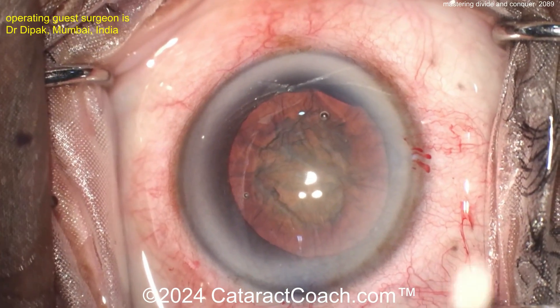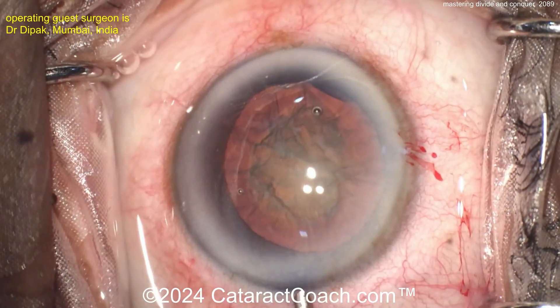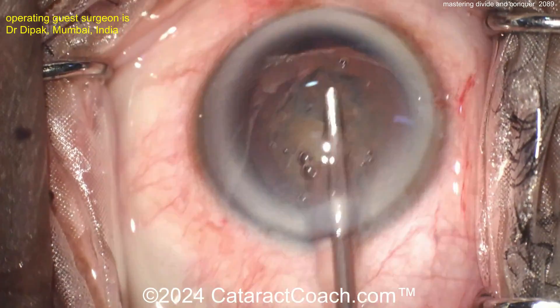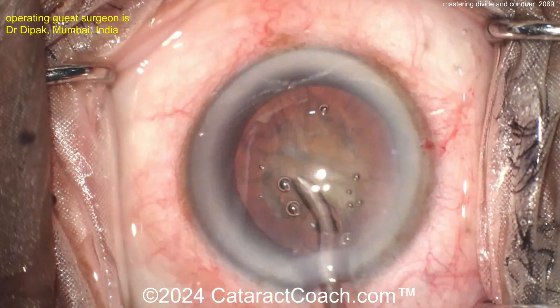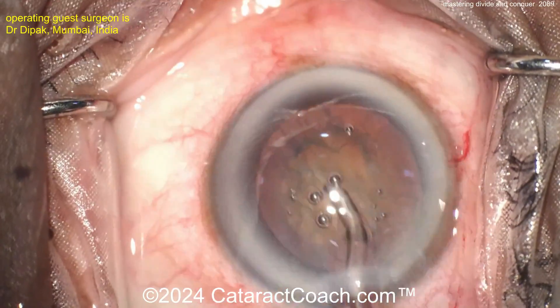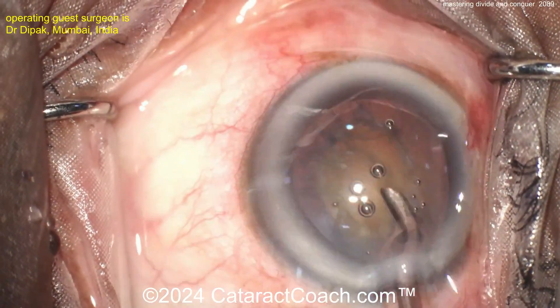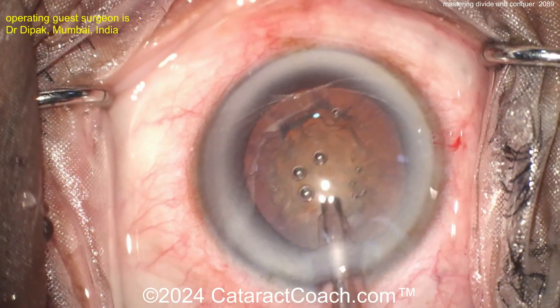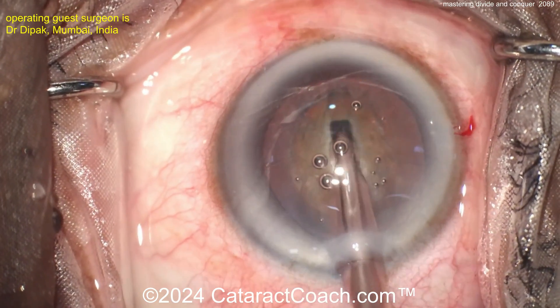Here comes the phaco probe. First we're going to sculpt the grooves. What settings do you want for the phaco for the grooves? Think about it. You want a relatively low vacuum — you're not trying to vacuum out a lot of stuff at a time — so vacuum less than 100 millimeters of mercury. Flow rate of 15 or 20 cc's a minute ought to do it. And phaco power — well, it depends on the density of the nucleus.